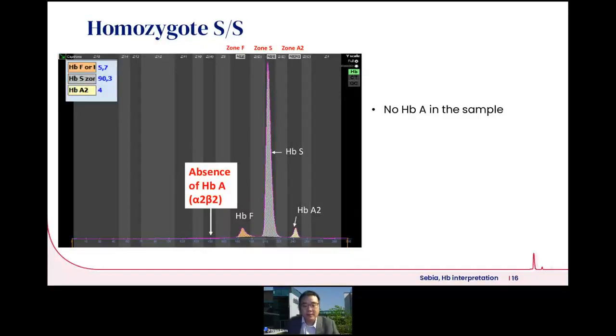This is a situation of homozygous sickle cell. You totally lose hemoglobin A because there's no normal beta chain to form hemoglobin A. The hemoglobin S peak would be the dominant fraction. Of course, there's elevated hemoglobin F as well.